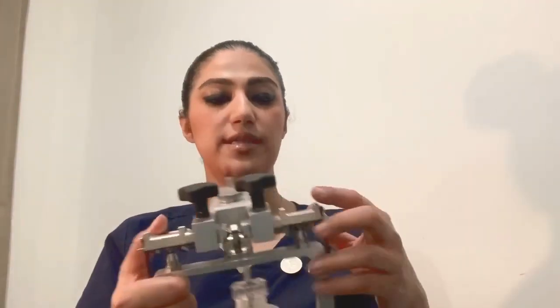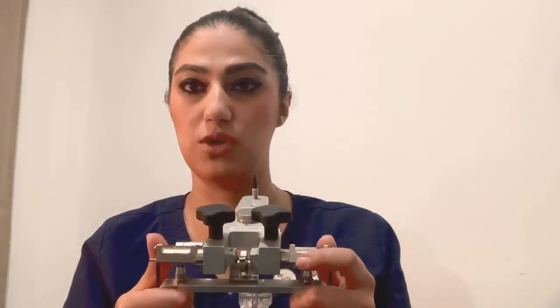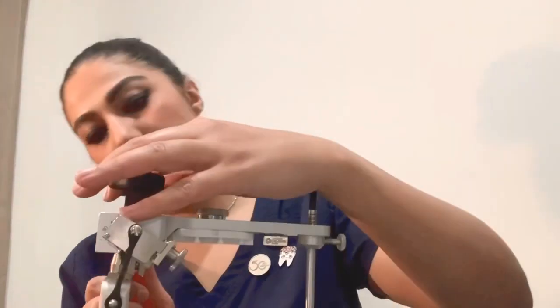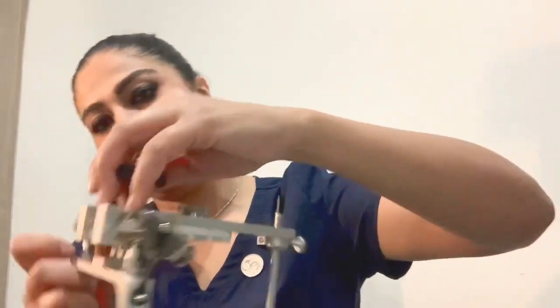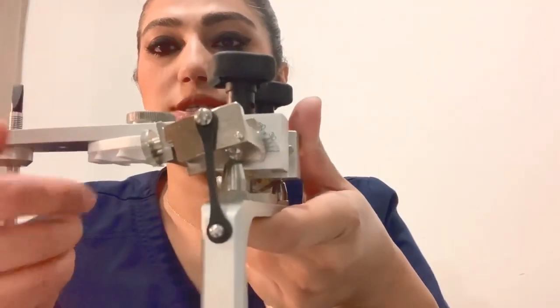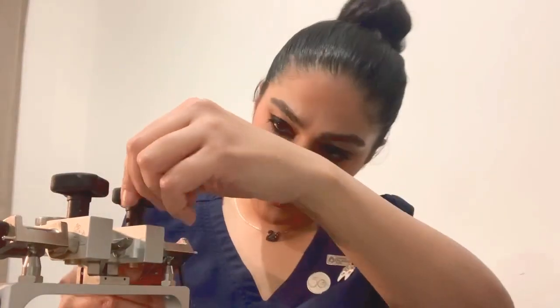You can see there are two big screws on the upper parts. This one shows the condylar inclination of the articulator. The average condylar inclination is 30 to 35 degrees. I can adjust it to 30 degrees here — as you can see, this is the angle in degrees that you can adjust with these two screws on both sides, and this one is also set to 30 degrees.